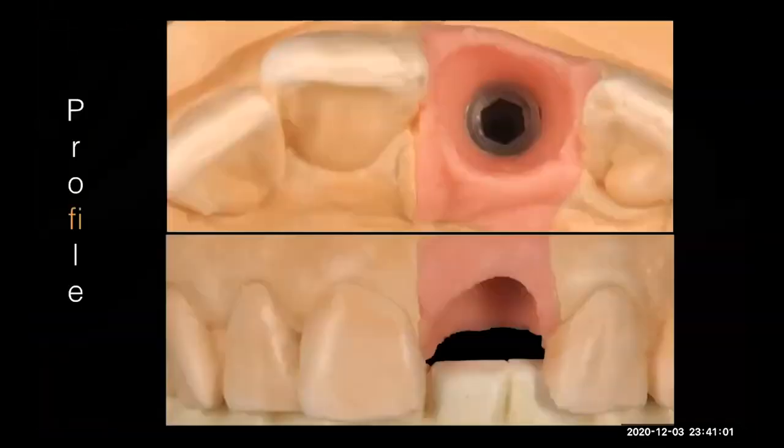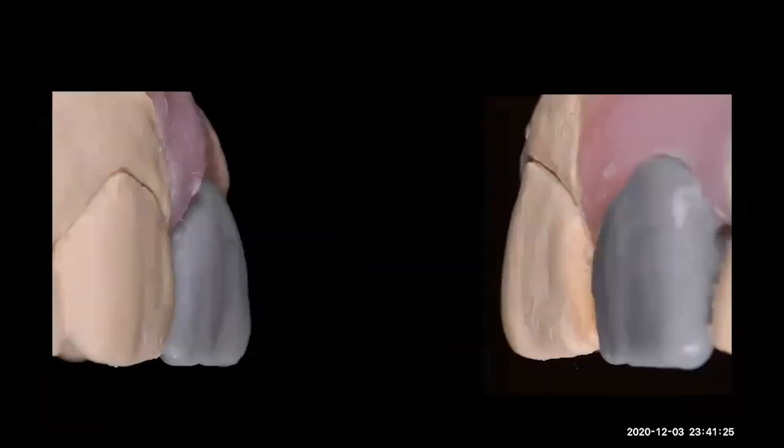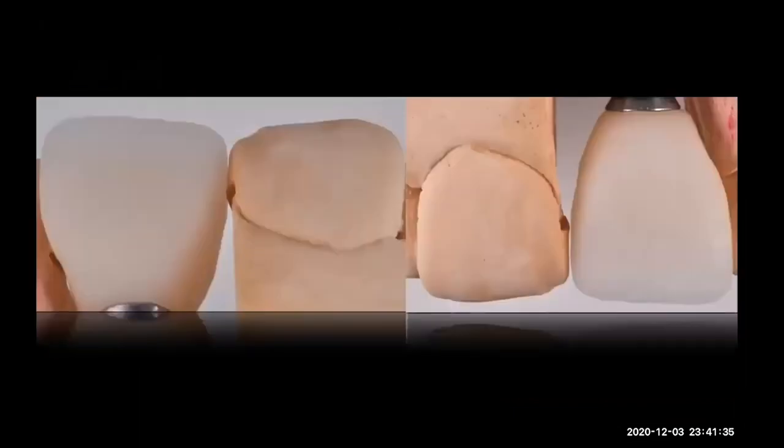This is the original model, model number one. You can see the geowax here in our model. I normally do two models. One is for delivering the crown, and the second is for doing our dirty job, because we do dirty work in the lab: shaping, carving, whatever we need to do. Then we press, and we can do our nice anatomy, our nice contours, following the tooth that we need to copy. Now we have the press, we have the feeding.